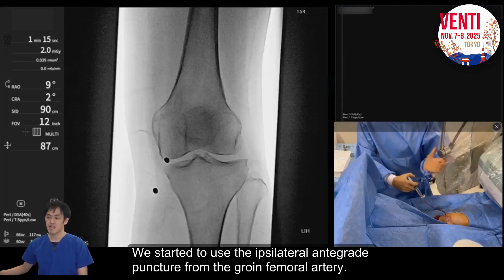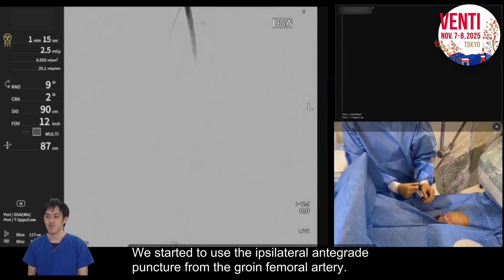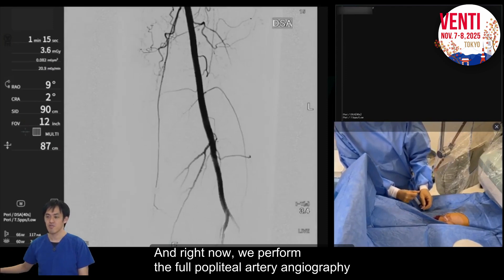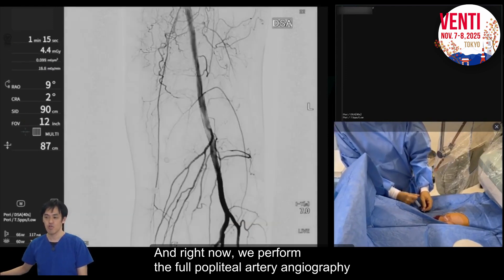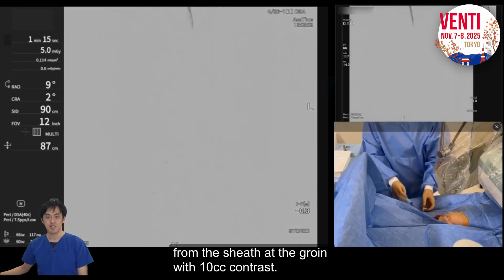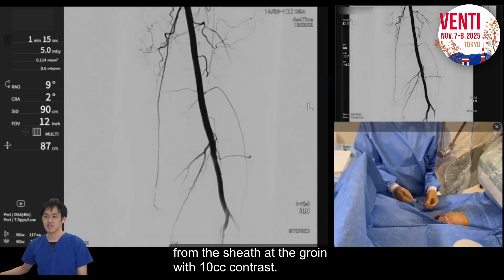We started using the ipsilateral antegrade puncture from the groin femoral artery. We performed the whole popliteal artery angiography from the sheath at the groin using 10cc contrast.